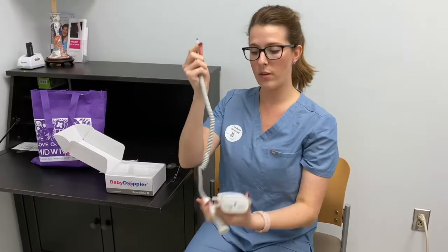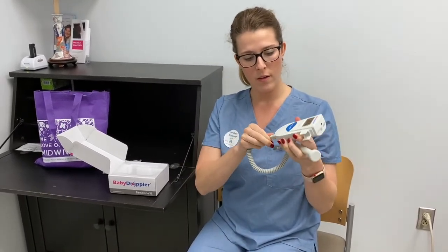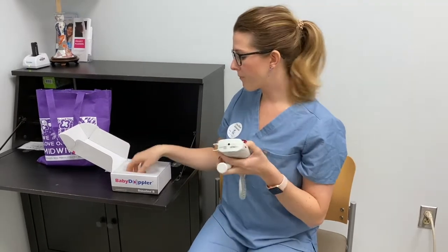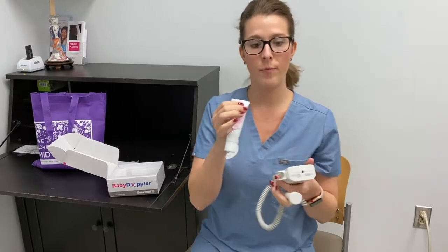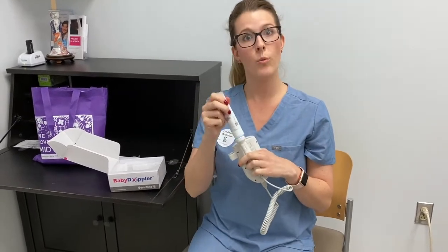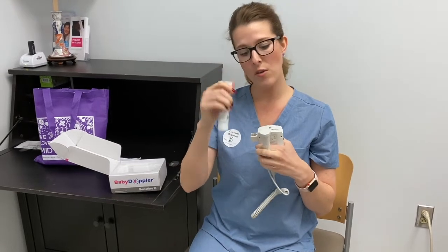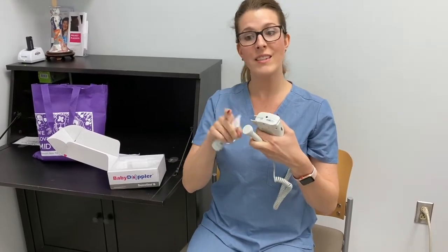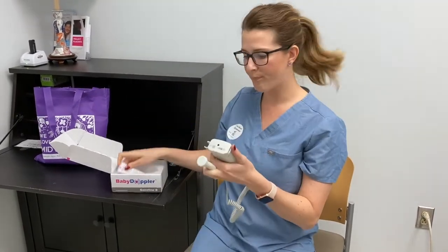Next, you plug the probe into the machine, and you're ready to go. The kit also comes with ultrasound gel. So you'll want to use a lot of gel when looking for heart tones. It has to have this liquid gel for the ultrasound waves to conduct and to hear your baby's heartbeat. So if you're ever having trouble, just try adding more gel.